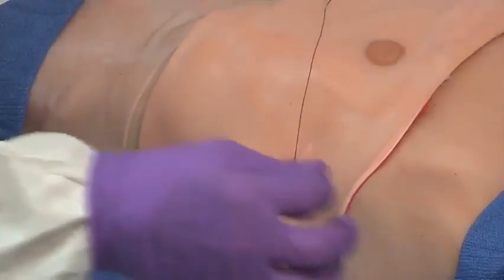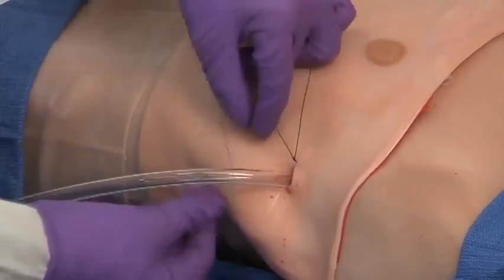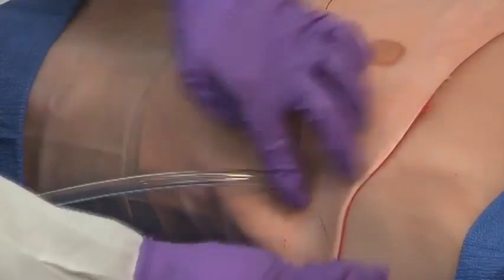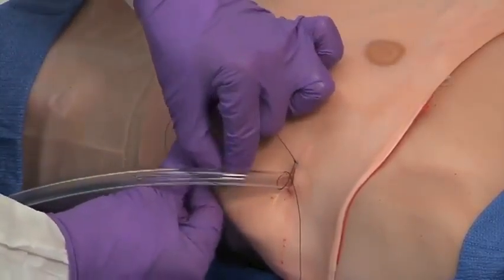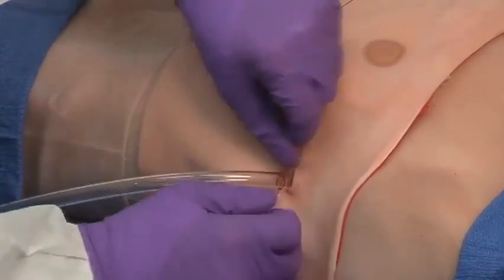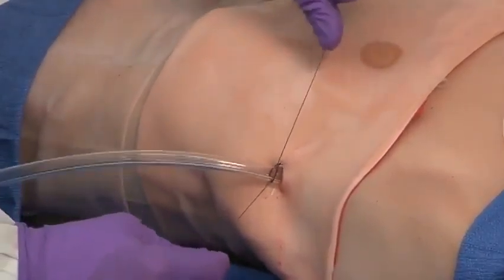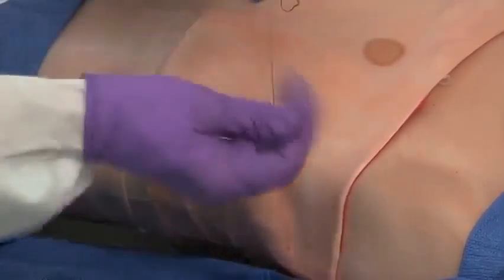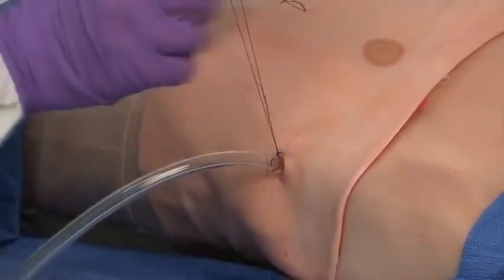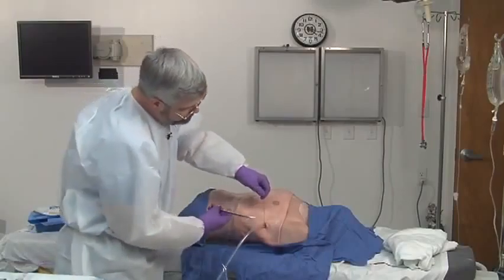And then we want to fix this firmly around the chest tube. The way I like to do this is to create a half hitch on one side of the tube, and then using the other suture create another half hitch, as you see, and then pull opposite on either side of those tubes so it now indents that tube. And while holding this under tension, I can now tie this down securely. The tube is fixed to the chest wall and not likely to come out. We then cut the suture.